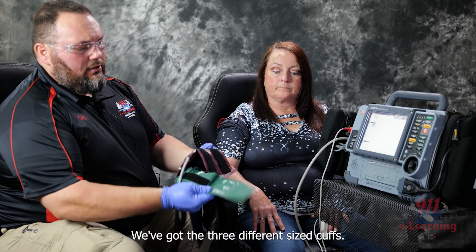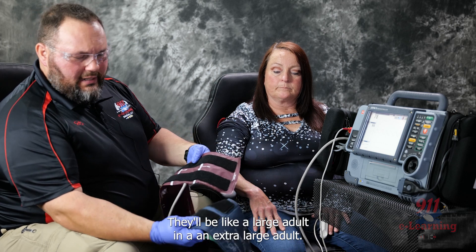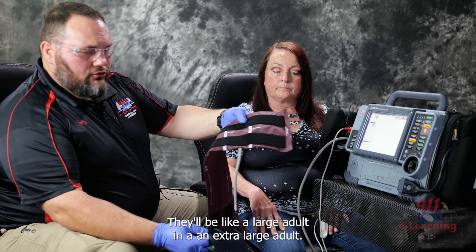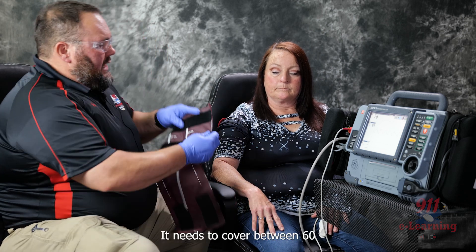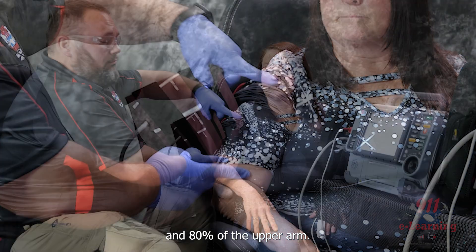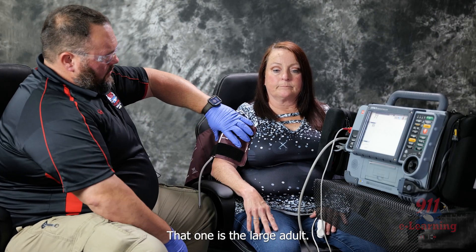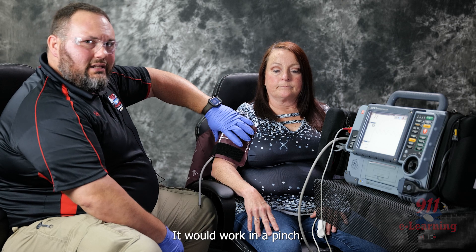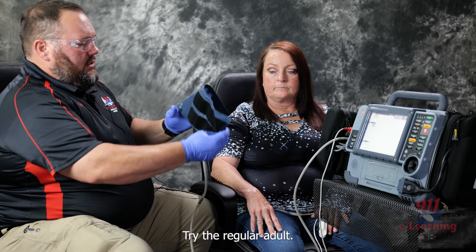We've got three different size cuffs. Some will have a large adult and then an extra large adult. You want to find the blood pressure cuff that fits appropriately — it needs to cover between 60 and 80% of the upper arm. The large adult would work in a pinch but it's a little too much, so I'm going to switch over and try the regular adult.